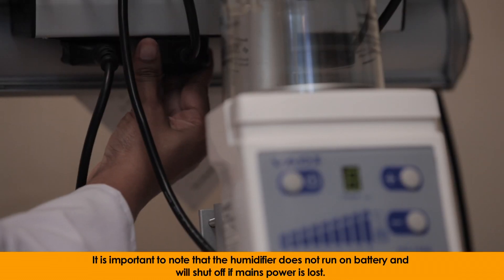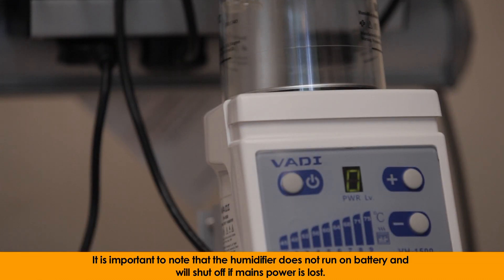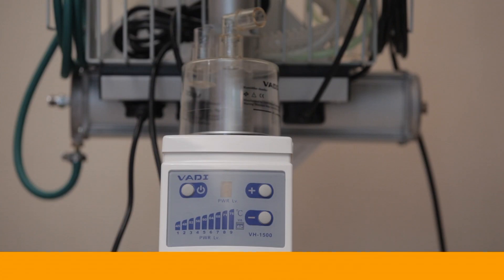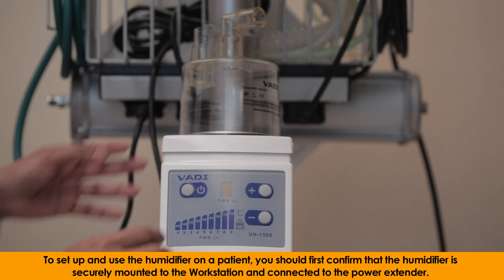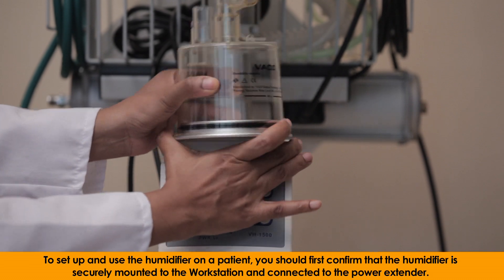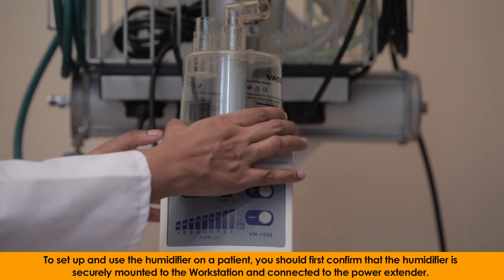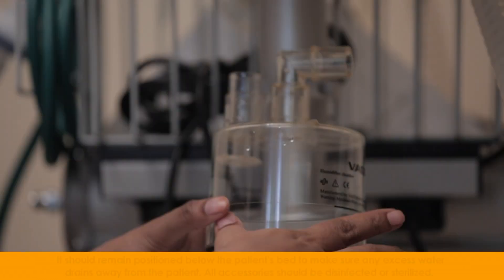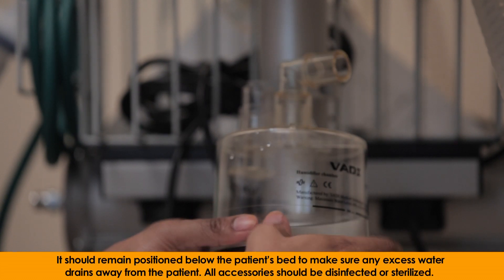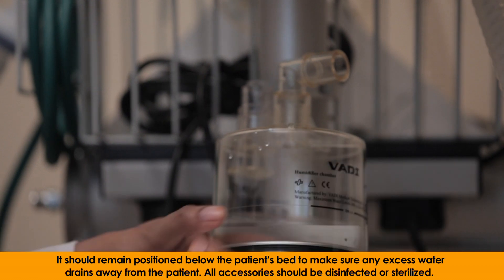It is important to note that the humidifier does not run on battery and will shut off if mains power is lost. To set up and use the humidifier on a patient, you should first confirm that the humidifier is securely mounted to the workstation and connected to the power extender. It should remain positioned below the patient's bed to make sure any excess water drains away from the patient.